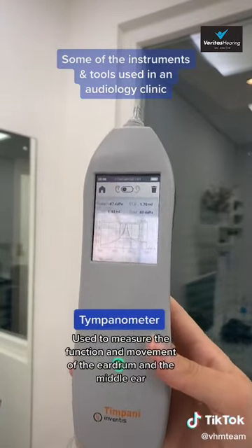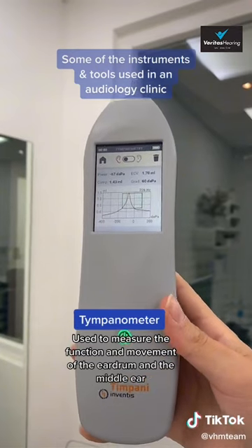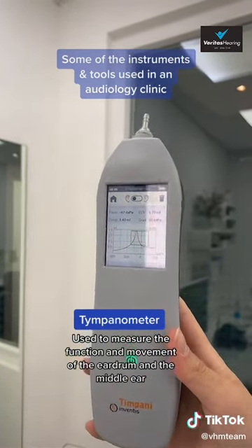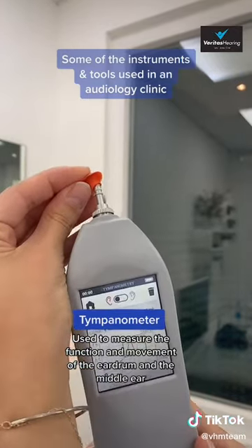This is a tympanometer. It's used to measure the function and movement of the eardrum and the middle ear — for example, to check if there are any fluids in the middle ear.